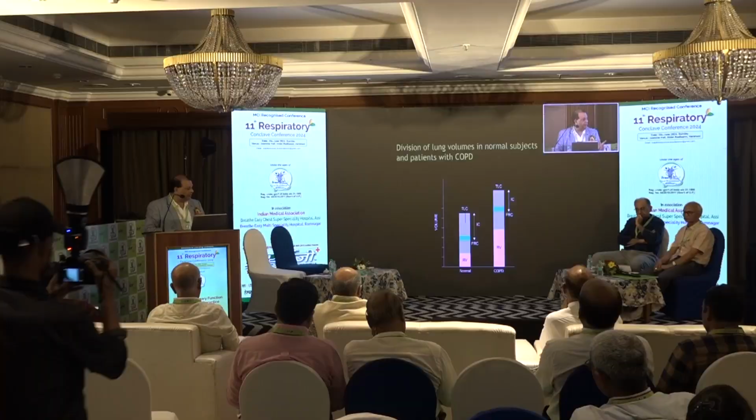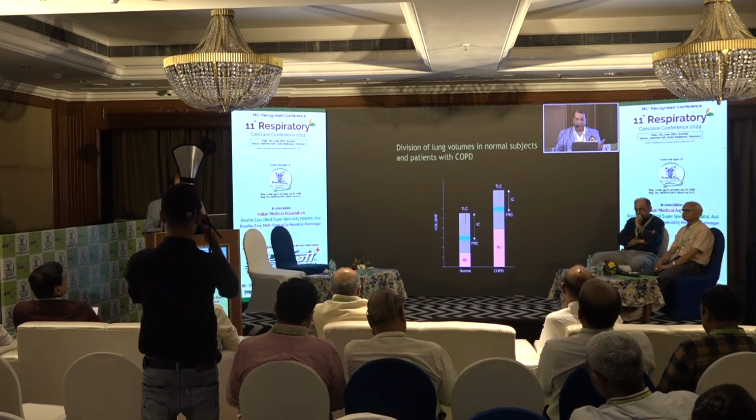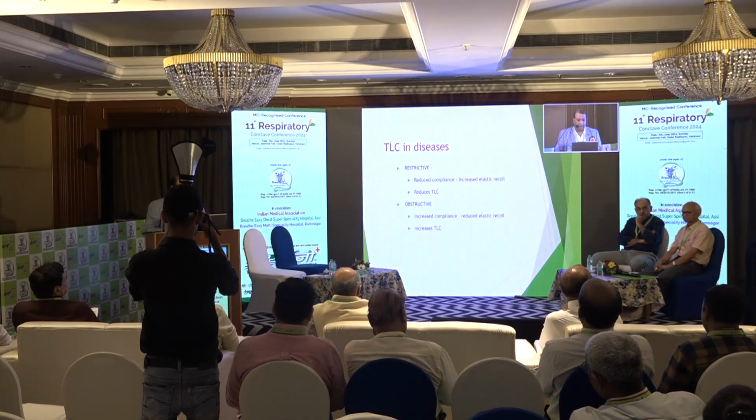These are graphical presentations where we measure the lung volumes, with many differences. The predicted normal values, and the normal range is 90% of the healthy normal population.